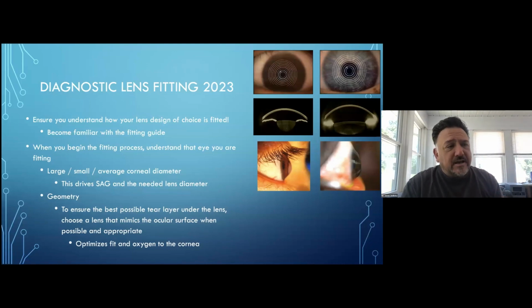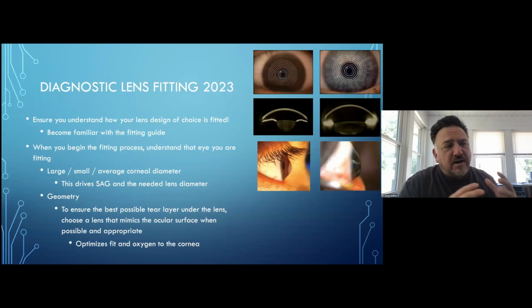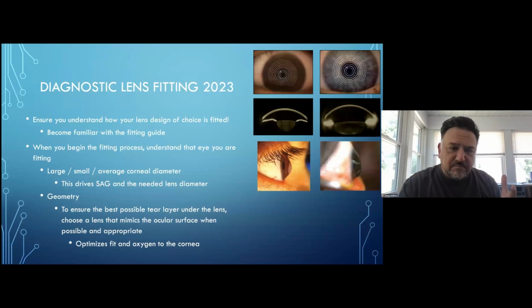It is important. I realize that when we're fitting an eye, a scleral lens, we're vaulting over that whole thing. I get it. You say, well, what difference does it make what the shape of the lens is? The difference the shape of the lens makes is that if I want to have a specific amount of vault, and I should have a desired amount of vault, that might be different in a patient who's a cone and a graft. My cone patients, I worry if that cone progresses and that apex touches the back of my lens, do I develop contact? I may want to fit my cone a little bit deeper with more vault than a graft patient, where I've got a fairly broad central area of the graft. And so if by chance I touched, it's not going to be focal, but I want less vault because I want more oxygen to that cornea. So my approach is going to be different for each type of patient.